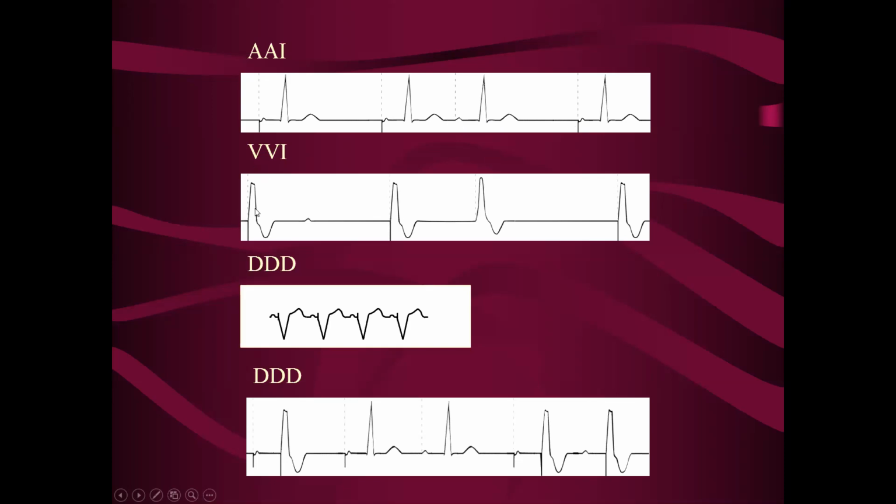And here you can see a pacemaker pacing in the ventricle and therefore sensing in the ventricle. When it sees intrinsic QRS signals, it resets the timing. This third ECG strip is showing what a DDD pacemaker would look like. You can see a P wave, and whenever there's a P wave, there's also a paced wide QRS, so it's pacing in the ventricle. And this is where the triggered part of the dual response comes from.